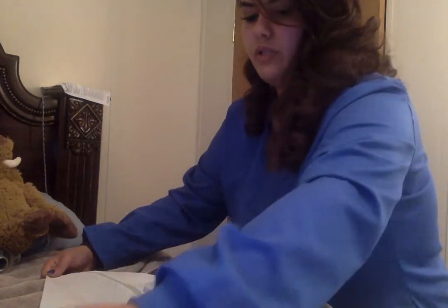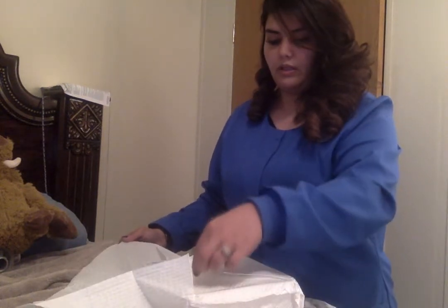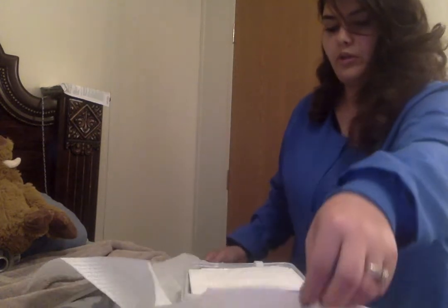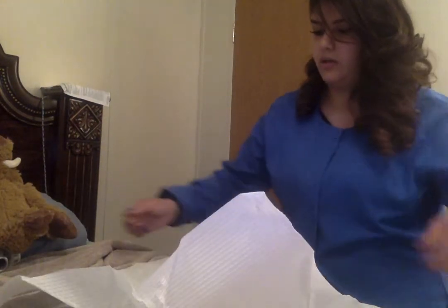And then open this side, making sure it's an inch away from us. And then this side. And then away from us. And we're going to make sure that nothing is touching our sterile kit, or sterile field.